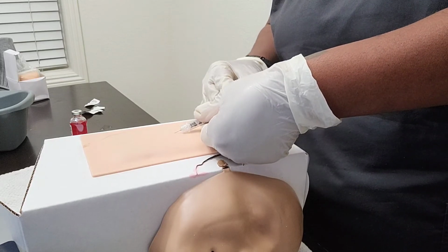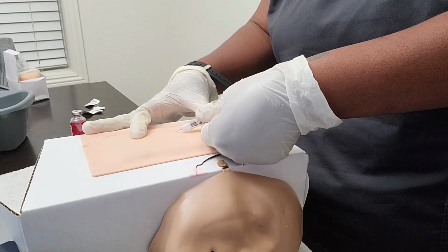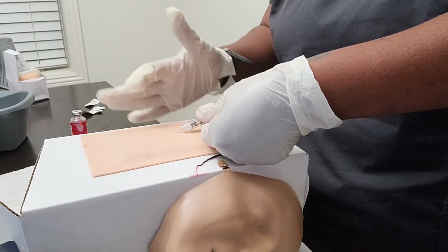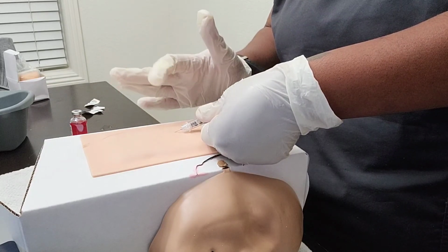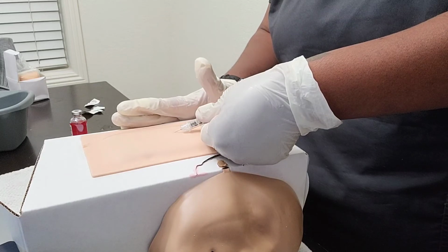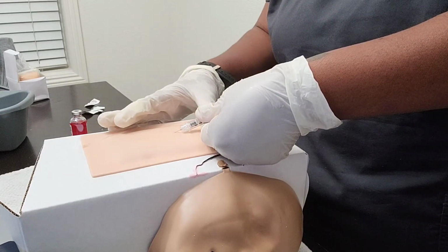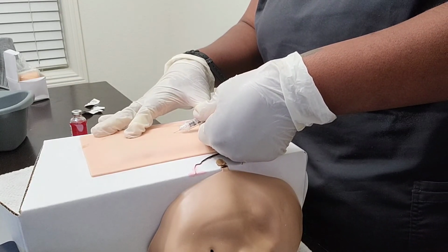Okay, so while I'm injecting the medication, I should see a small little bleb, resembling a mosquito bite, that appears on it. So I inject, and then I'm going to withdraw the needle.